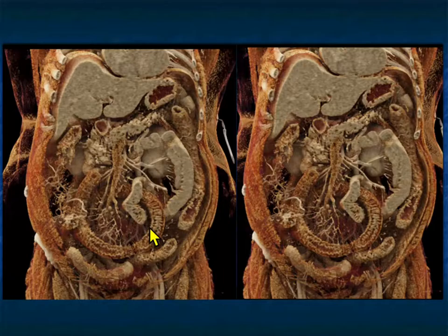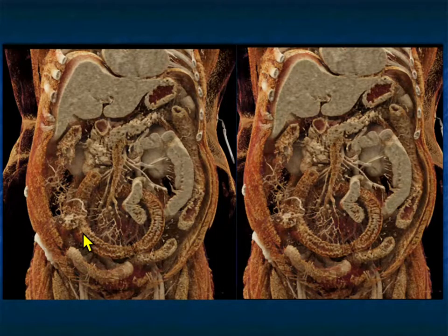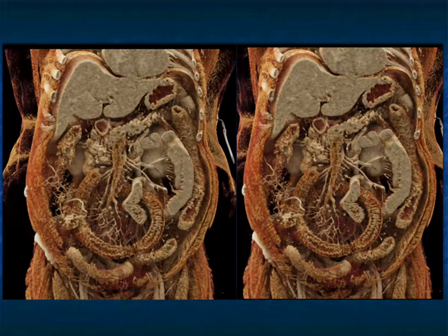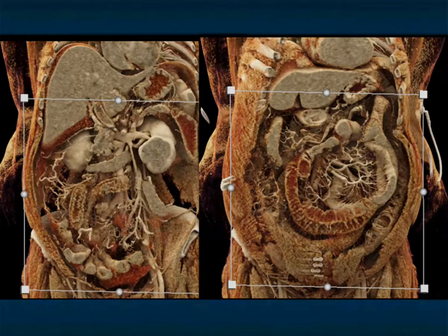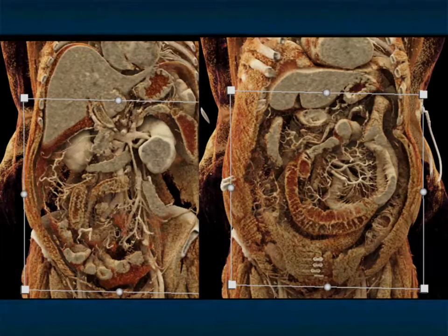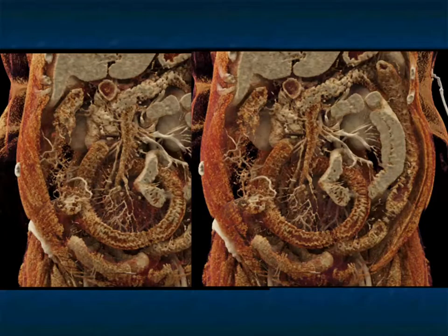In the right setting, this could be graft versus host, it could be ischemia, it could be Crohn's. Look at the mucosal enhancement, the submucosal edema, the vasculature — the thrombus is really nicely shown on these images. The ability to look at colon and small bowel using cinematic rendering is something we're putting a lot of effort into, and you'll see some new articles about that soon. Look at the detail in this patient with ischemic bowel.